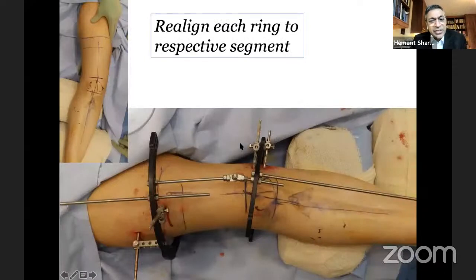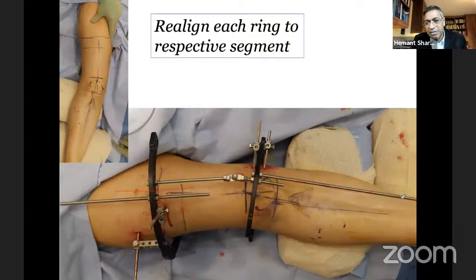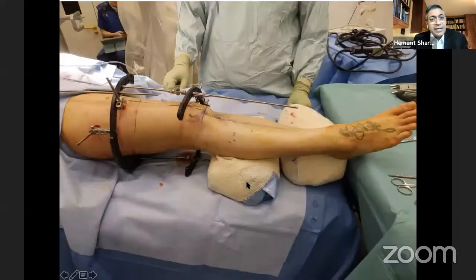This is an example of a hinge assisted correction, where if you see, these are long rods which are going to the center of the ankle. This is going to the piriform fossa, which is the anatomical planning, and you put your hinge where you want to do it. Once you've aligned it, and we all draw lines like Mangal showed in his case, then leave the space because there is plating here. I've left the space for plating, and I'll show you another example later on as well for that.